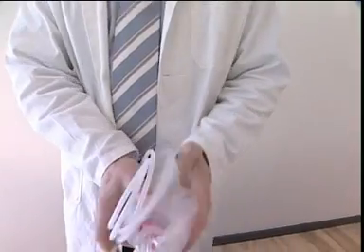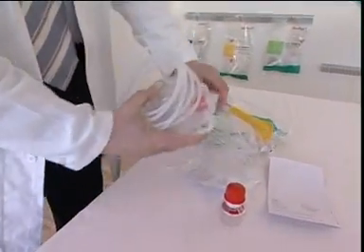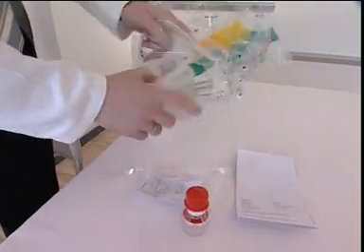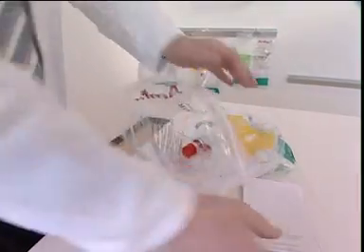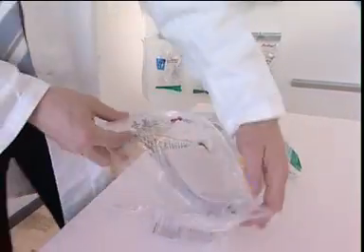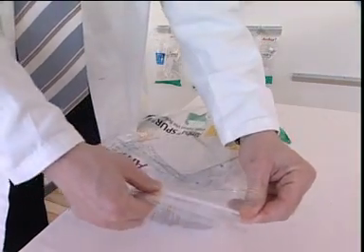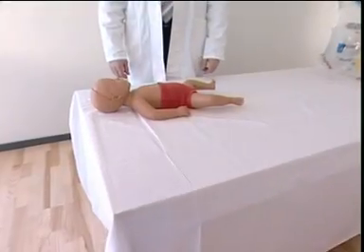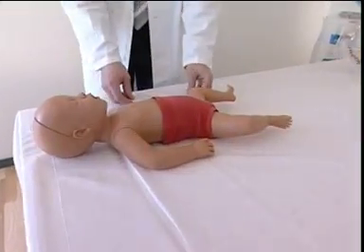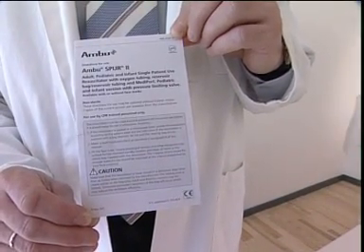When ventilation has been terminated, put the SPUR II and accessories back into the carrier bag and keep it close to the patient for possible later use. Throw away the SPUR II if it is not intended for any further use on that specific patient. For further questions regarding the SPUR II, consult the directions for use placed in the carrier bag.